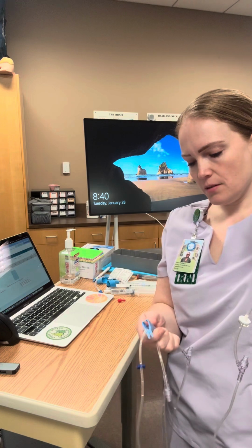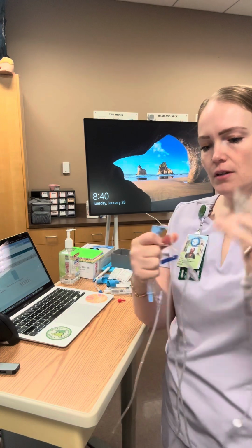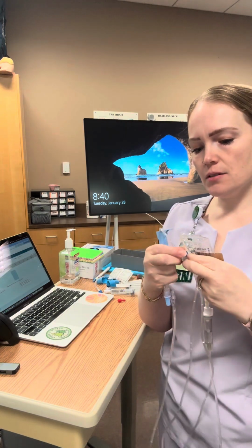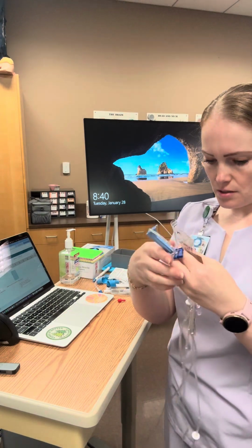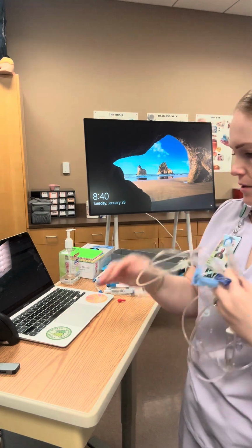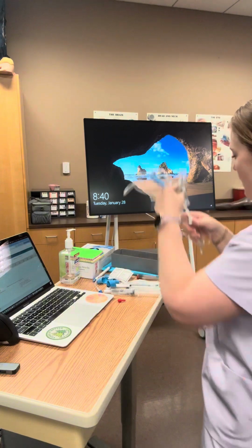I'm going to clamp with my roller clamp. I can also clamp off with this little key here. Okay, my medication is prepped. I have that ready to go.